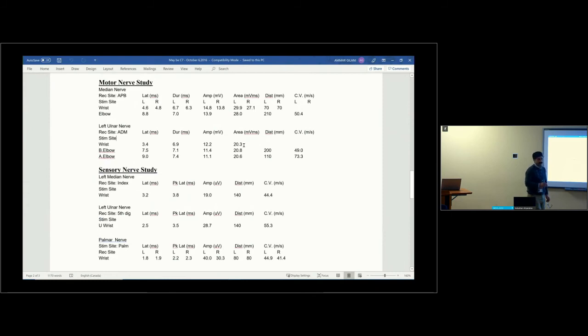I've been doing EMG for 20 years. I had 2 cases of L5 radiculopathy where peroneus was not affected, but almost every other patient had peroneus longus abnormal. So if you don't do it, you're going to miss it.